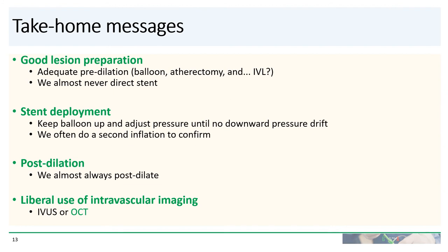So here are some take-home messages. Good lesion preparation is important. In my practice, I almost never direct stent. I will pre-dilate with a balloon, or if the lesion is especially calcified, we'll perform rotational atherectomy, and hopefully very soon in the future, intravascular lithotripsy.